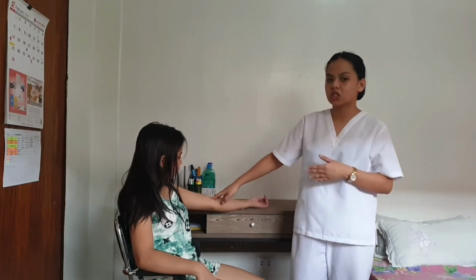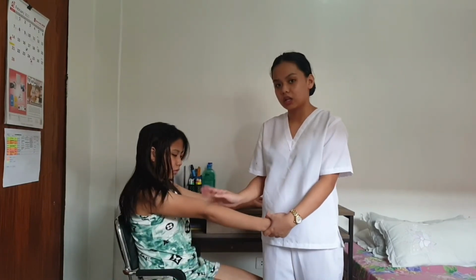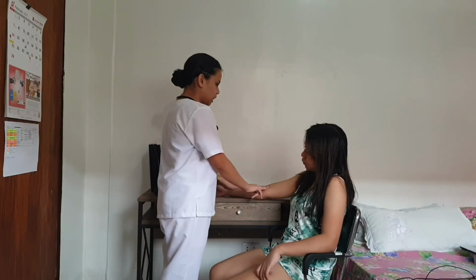Okay, so it is much easier to use the right arm of the patient. So I'm going to use the patient's right arm for the initial assessment. I have now located her brachial artery, so this will help my reading to be accurate.